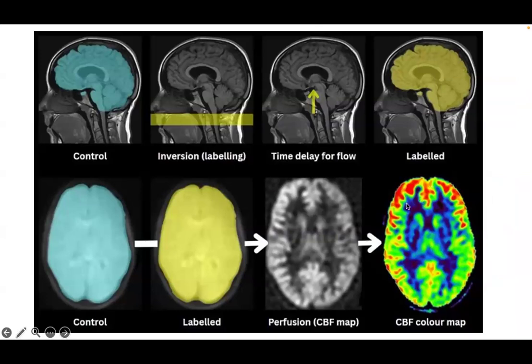A very important thing is that there can be spurious increased signal anteriorly as well as posteriorly, especially in the posterior cingulate, where the default mode areas are. Also, when the patient is blinking or has the eyes open, it can cause occipital hyperperfusion.